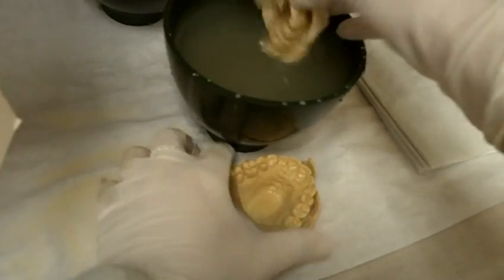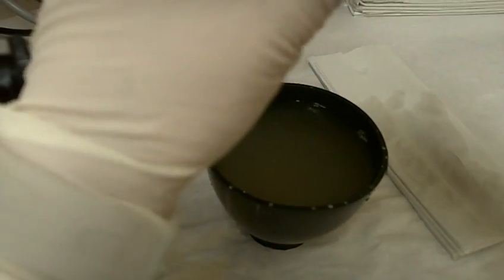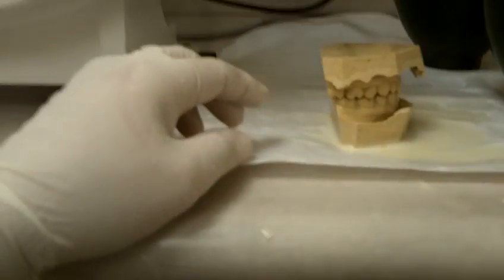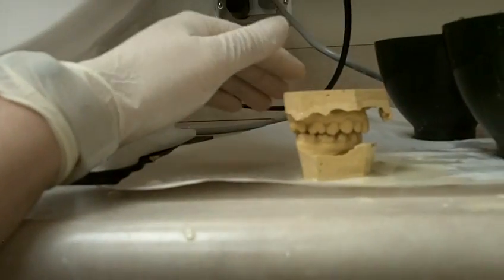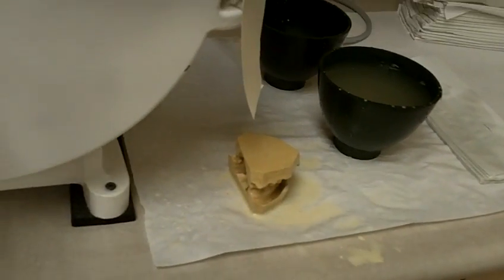We're rinsing it off. Putting it together. Seeing how it looks. It looks good. It's parallel. It's not sticking up like this. So the next thing, all we have to do is clean it up.